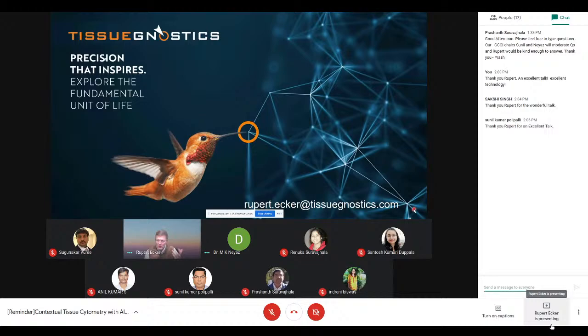Because you can use quantitative and observer-independent data, of course using systems that are certified, that go through clinical studies and something like FDA approval. This will also reduce the need for second opinions or moving samples from rural areas to the big centers, be it physically, by sending the tissue sections or slides there, or by using telepathology. Internet is getting better and better, but those images, as we have seen, are really huge.